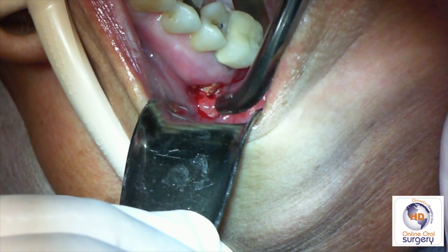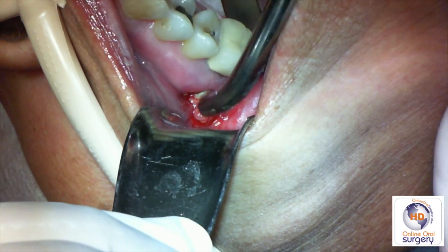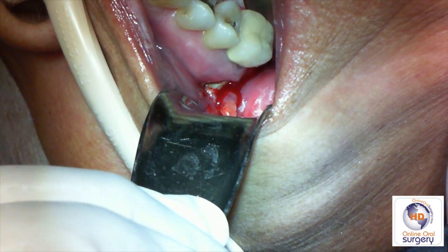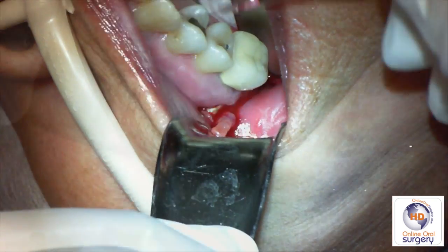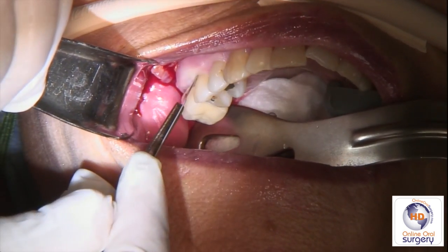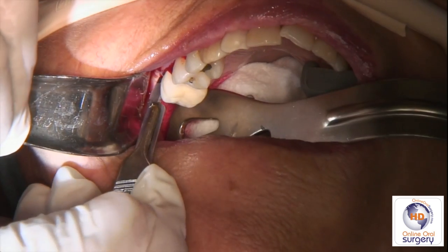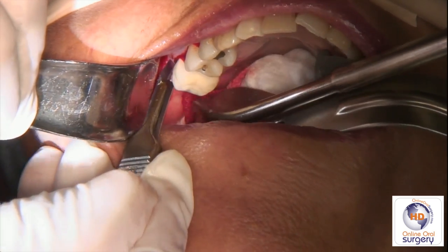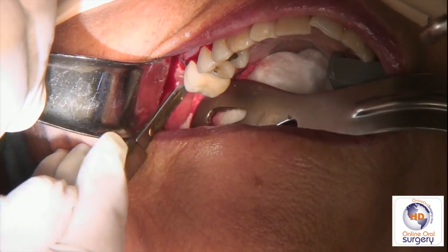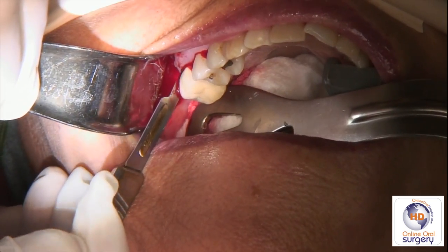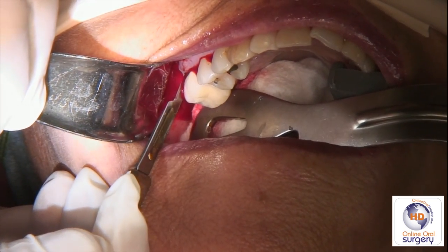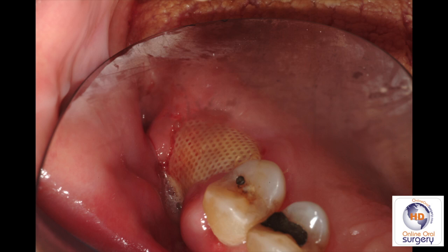You can see that underneath the flap of tissue there is a lot of inflamed, friable tissue that's going to need to be removed. We're going to start by making a sulcular incision between the first and second premolars — that's why we had to give local that far anteriorly — and then carry it into the sulcus distally, around tooth number three which we're extracting, and into the maxillary tuberosity region, as we'll be elevating and reflecting the flap that far.